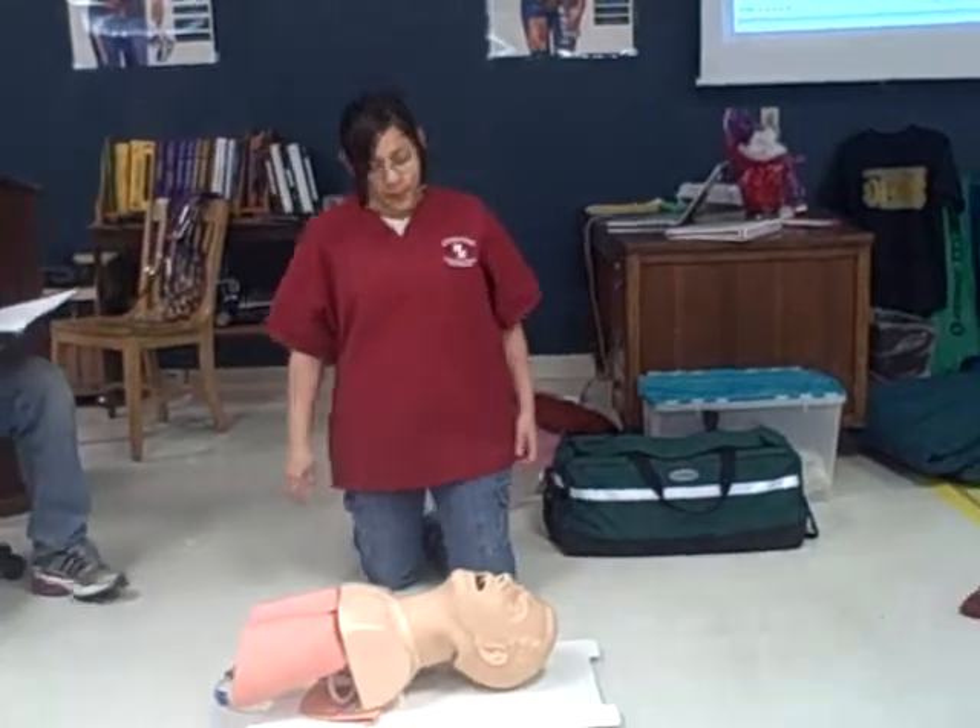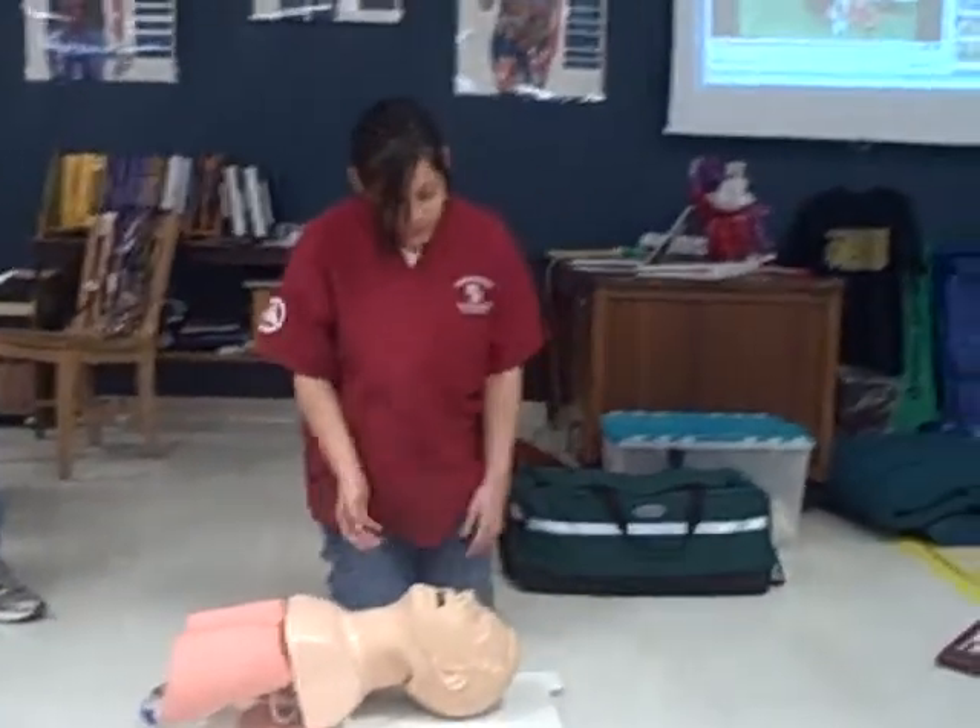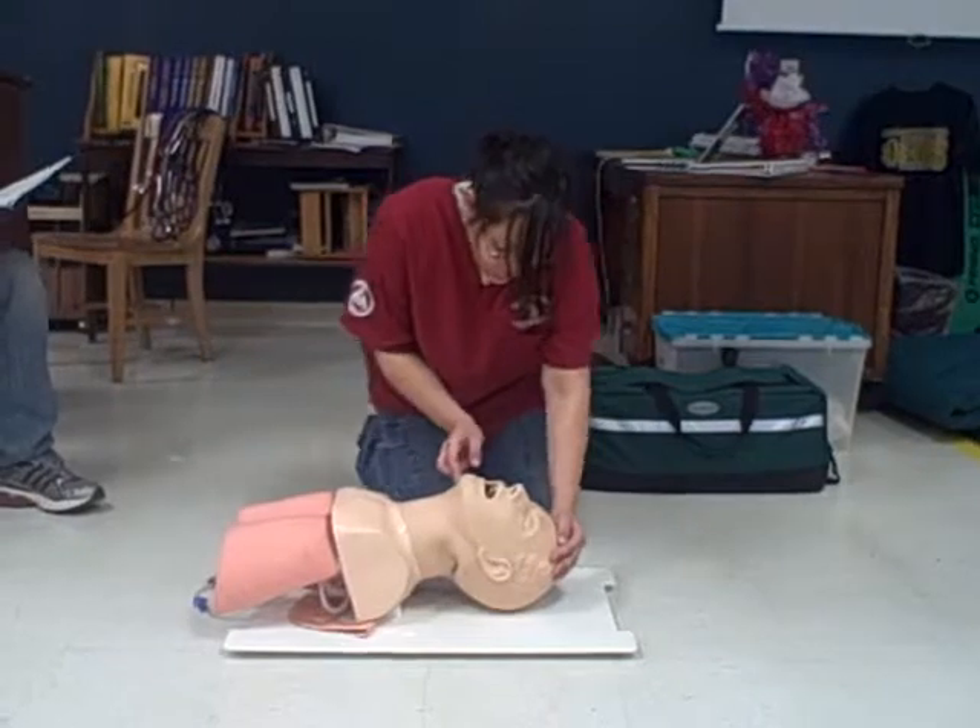All right, BSI for my buddy and I. The scene is safe. I'll begin by opening the airway by doing a head-tilt, chin-lift.